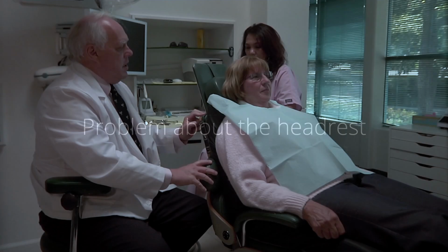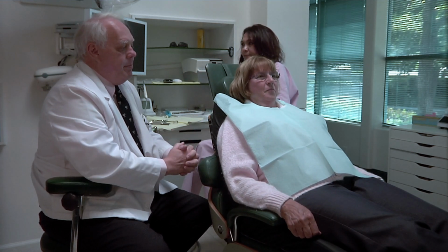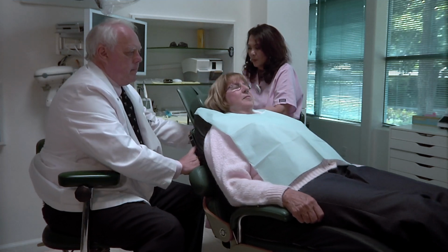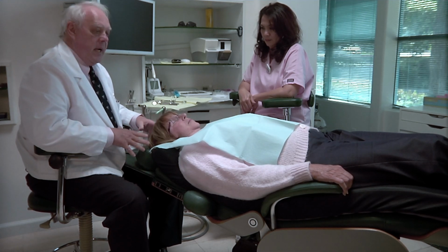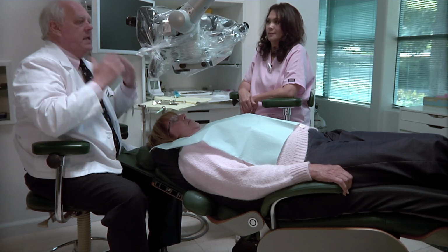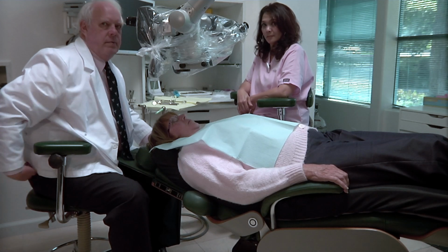Why we recommend removing the headrest. It's really an ergonomic thing. If you look at the chairman chair with the extended normal headrest on it, every patient is a little bit different, and how they sit in the chair, the position of their head is never the same really, because sometimes they have to scooch down in the chair to get comfortable.